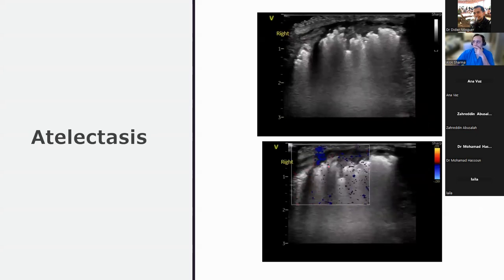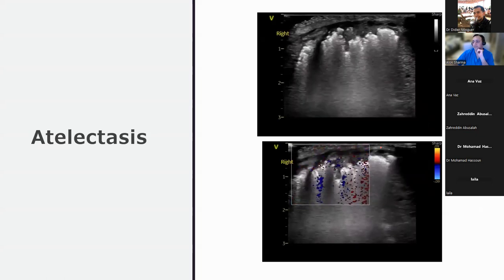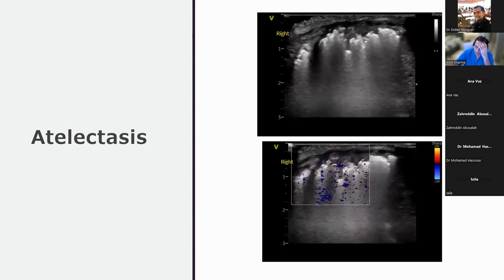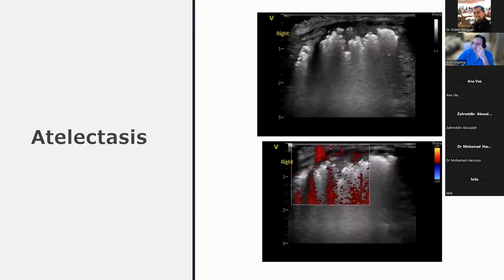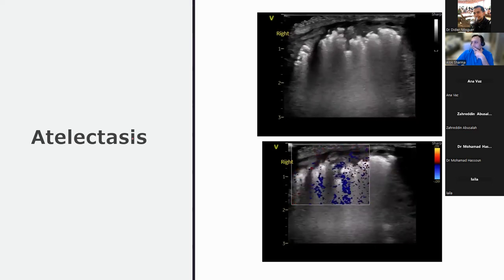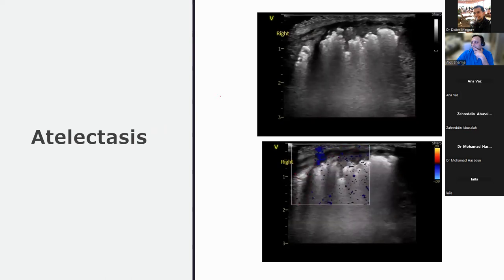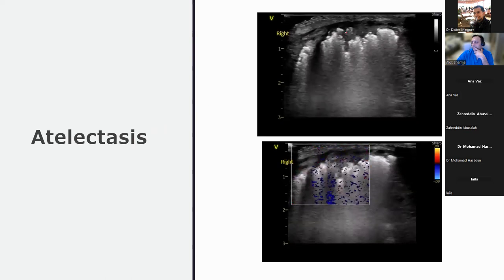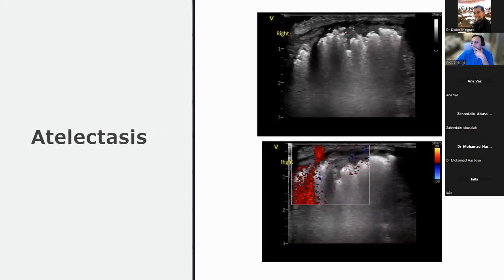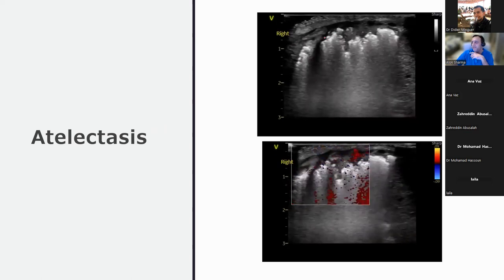So, okay. This is the same baby at a much later time on the right lung. I'm just giving you an example. The baby is actually much further down the line. So, what do we think about this image? Also, the pleura is very irregular. Yeah. Deep consolidation. And I don't see the pleural margin here also. Yeah. So you have no pleural margin here.